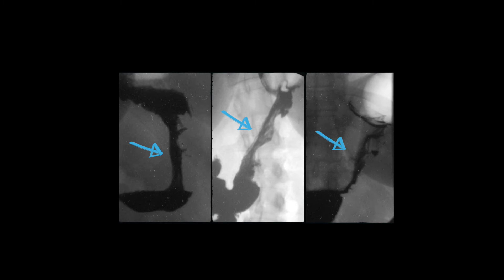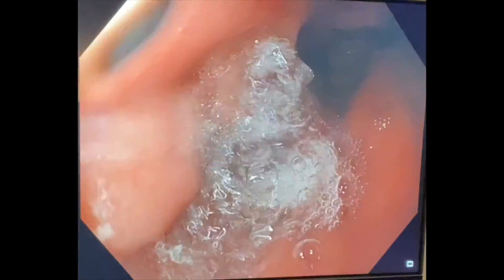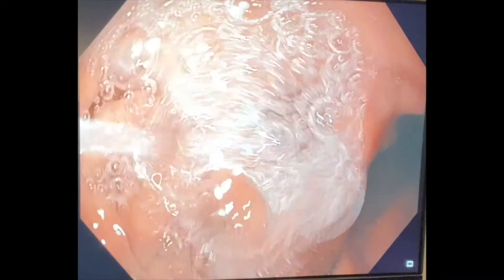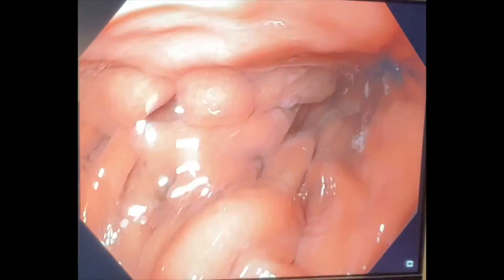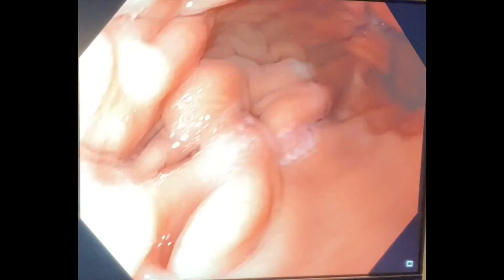We've seen this in our program with countless evaluations of stomachs a year or more following ESG. Here are just a few radiographic examples of what the stomach looks like after a year or longer, and you can still see preservation of that narrow sleeve-like shape in each example. We've also seen this endoscopically. Here's a patient who had an ESG over a year ago and has lost more than 25% of her total body weight. You can see complete preservation of the ESG — no visible or loose sutures. They're all healed within the stomach wall, the stomach remains very narrow in the middle, and it's actually still much shorter than a normal stomach. There are mucosal bridges that have healed over the sutures. Ultimately, all sutures have remained intact and this person will have long-term durability.